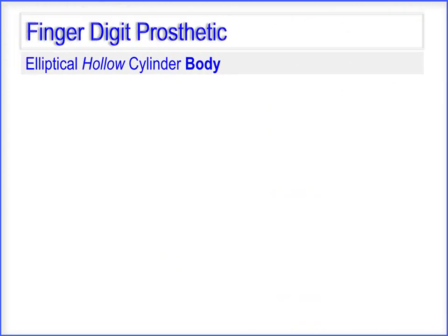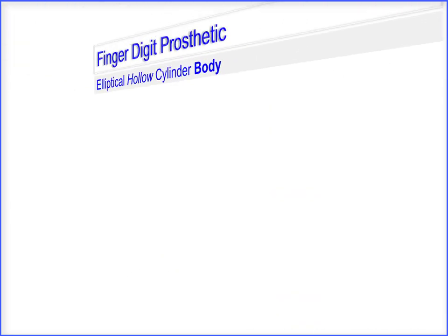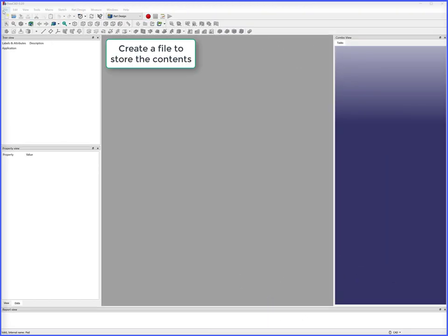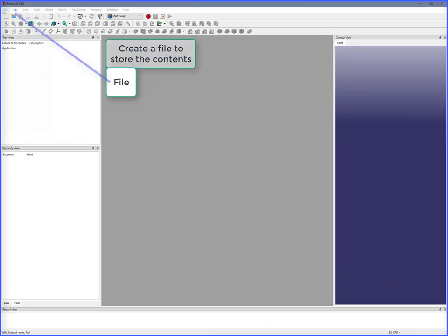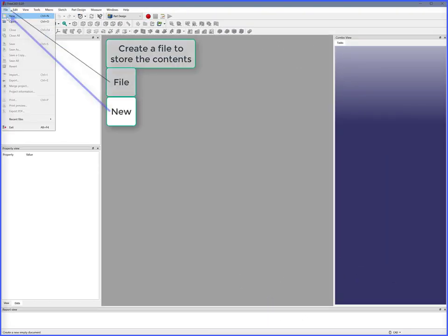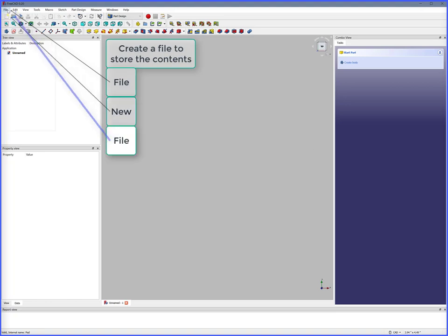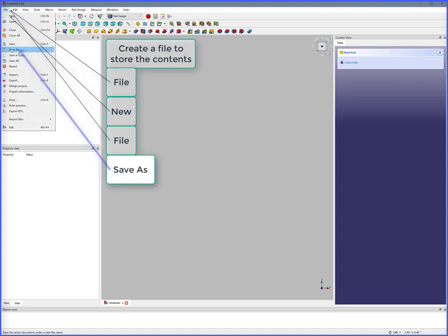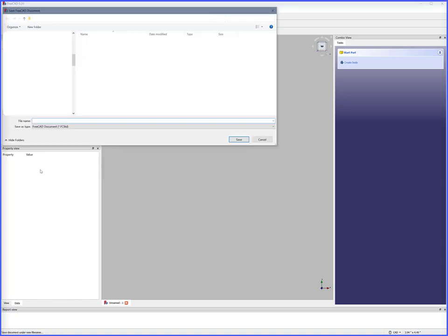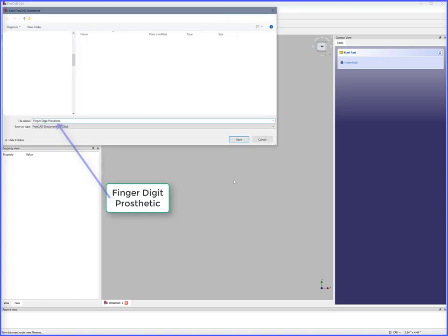We'll start with an elliptical hollow cylinder body. To start this project, we create a file to store the contents: File, New, File, Save As, Finger Digit Prosthetic.